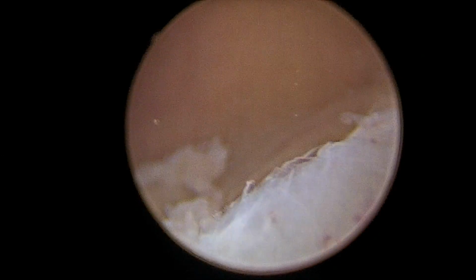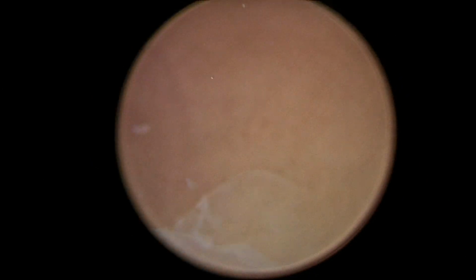We can see it was on a diagnostic hysteroscopy. We are showing a normal uterine cavity without any indentation of the endometrial cavity. But ultrasound was showing that there was a submucosal fibroid, and the patient had presented with dysmenorrhea and menorrhagia.